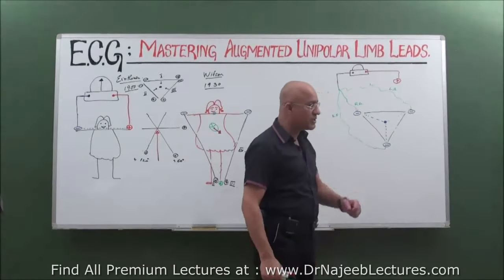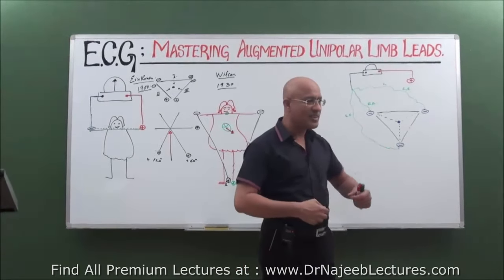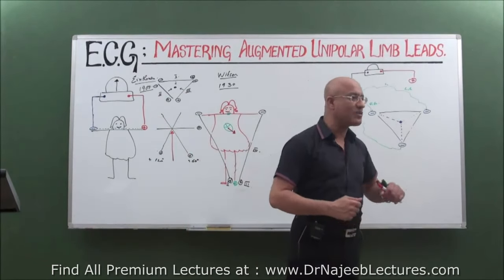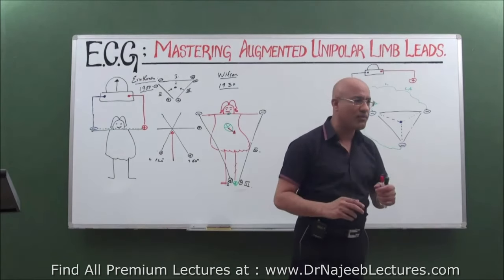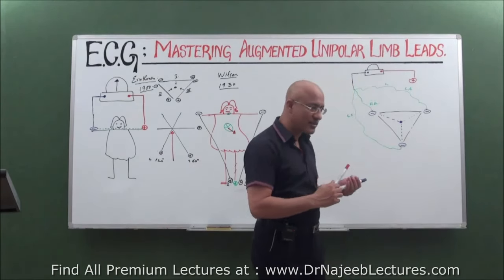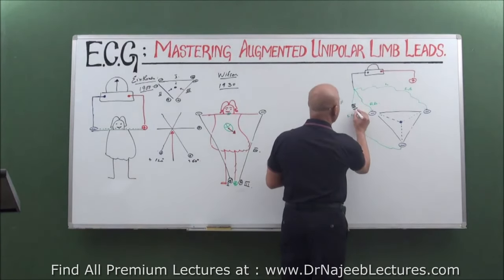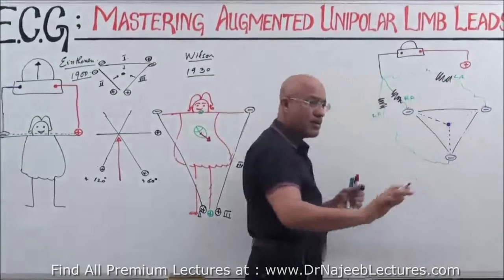Mr. Wilson was very sharp. He said, okay, there's a little problem. You are right. The triangle made by the right arm, left arm and the leg is not perfectly equilateral, and the heart is really not in the very center. So a little bit of current will flow. So this doctor put very strong resistors everywhere, to prevent that little bit of current fluctuation.